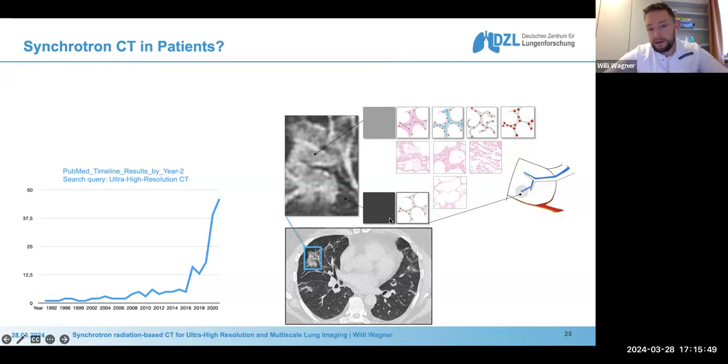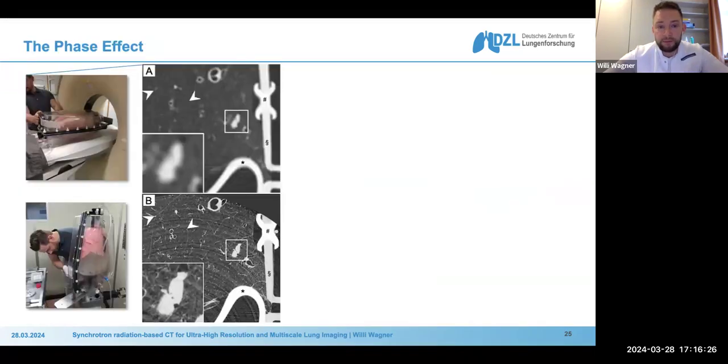That's ground glass opacity, that's normal lung. Normal lung structure, we know what that looks like, but many different pathologies can result in ground glass opacity, okay? And we need higher resolution in order to really understand what's going on in the lung. And if we had had ultra high resolution imaging, we would have understood much quicker, for example, what COVID-19 was doing. It took a long while until we understood why it was so bad for the people.